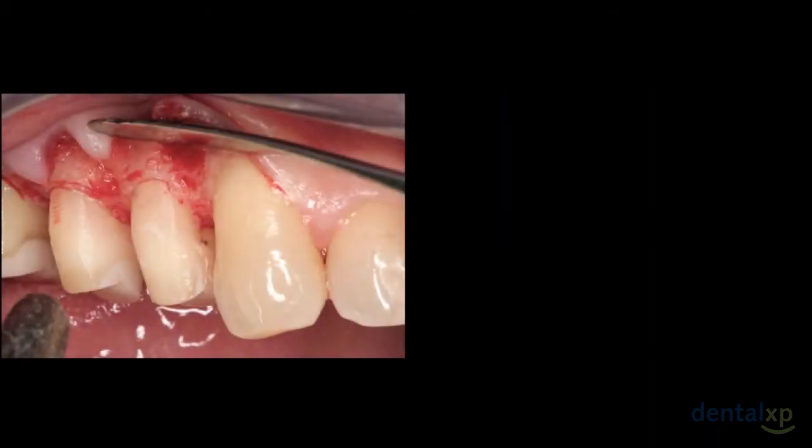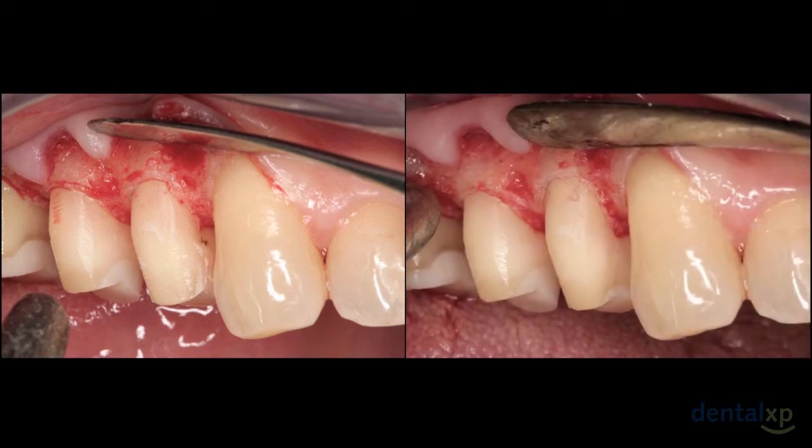So what we'd like to do is lay a flap, remove the provisional. If cores needed to be placed, the cores were placed, and now we have vertical access to work on the line angles. You can clearly see the calculus present as well as the concavity. After biologic shaping has taken place, the line angles are gone and the root surface is perfectly smooth.